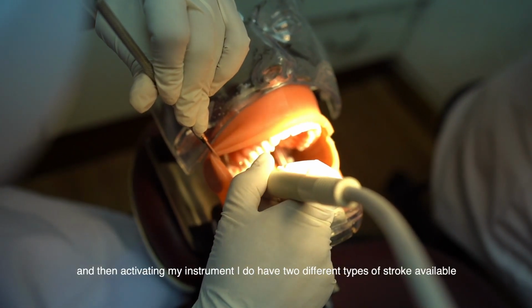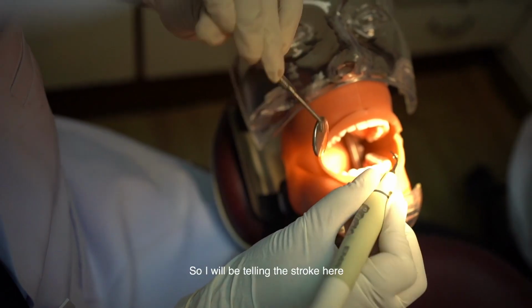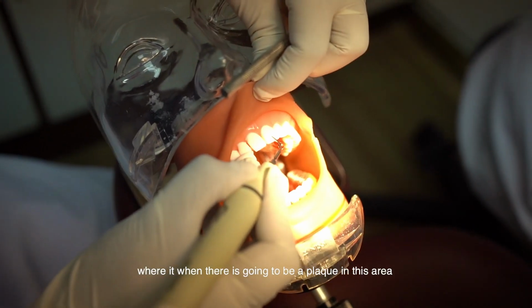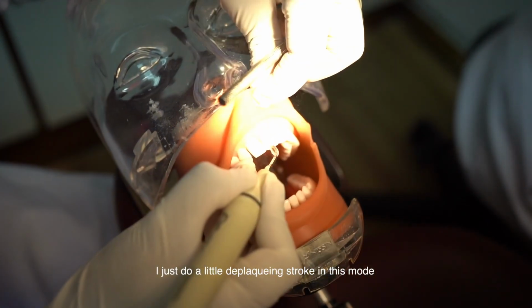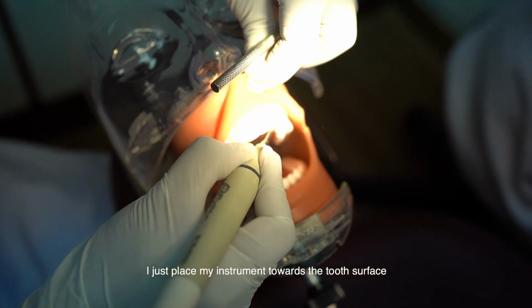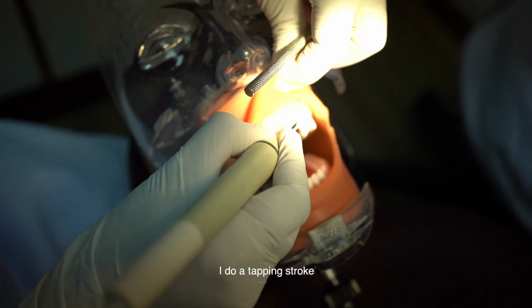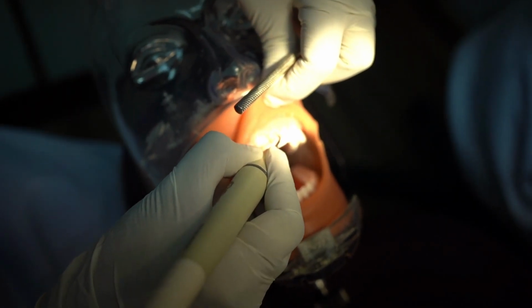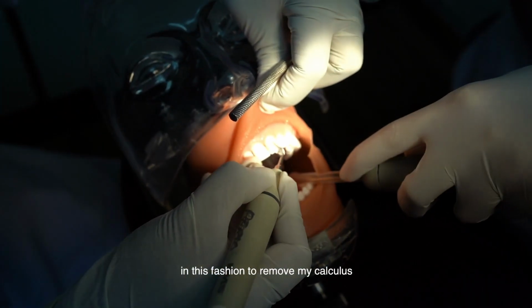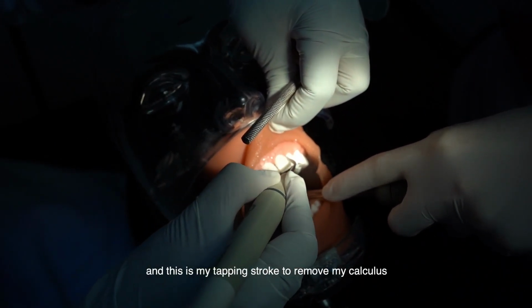And when activating my instrument, I do have two different types of stroke available. So I will be showing that stroke here in the anterior region for better visualization. When there is a plaque in this area, I just do a little deplaquing stroke in this mode, where I just sway my instrument towards the tooth surface. Whereas when I have a calculus near the cervical aspect, I do a tapping stroke in this fashion to remove my calculus. So this is your deplaquing stroke to remove your plaque, and this is my tapping stroke to remove my calculus.